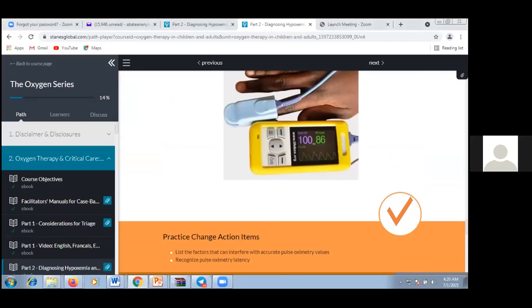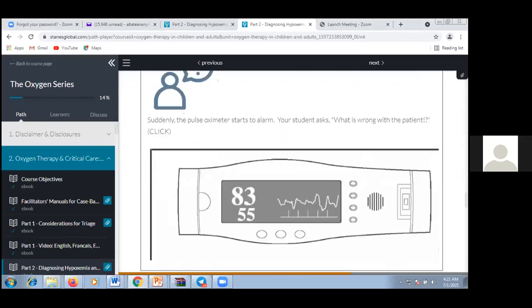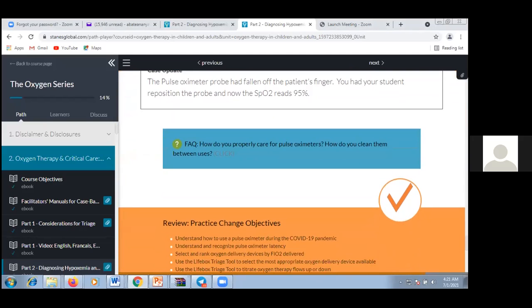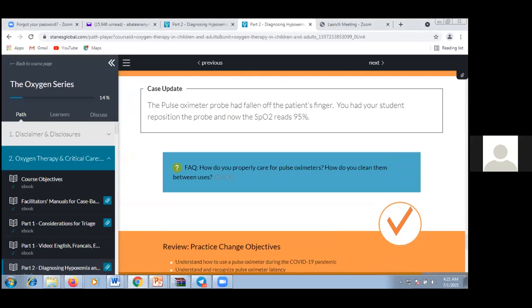Yeah, as you know, pulse oximetry is very delicate and sensitive, especially the sensor part. The battery, the microprocessor, and the adapter are also very sensitive. So the general care that we should take is at the time of use, during processing, packaging, and post-use.